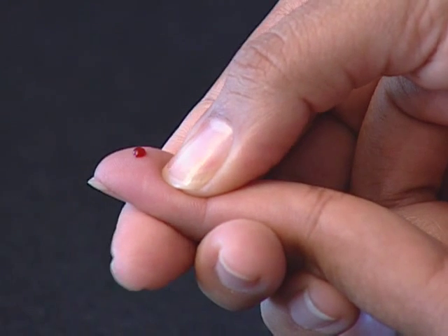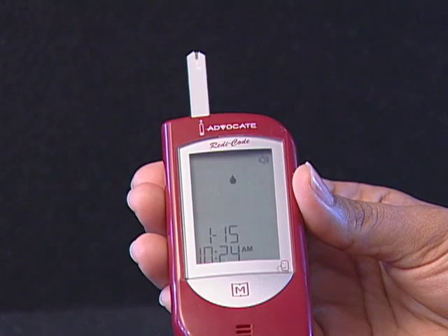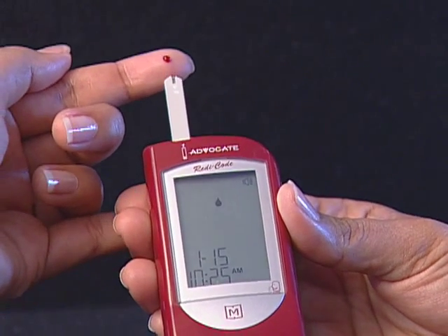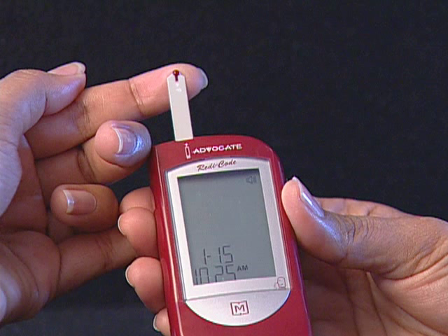Gently squeeze the punctured area to obtain blood. Be careful not to smear the blood sample. The volume of blood must be at least 0.7 microliters. Step 4: Apply blood into the test strip. When the small black icon is flashing on the screen, apply your blood to the absorbent hole of the test strip until the confirmation window is fully covered with blood.